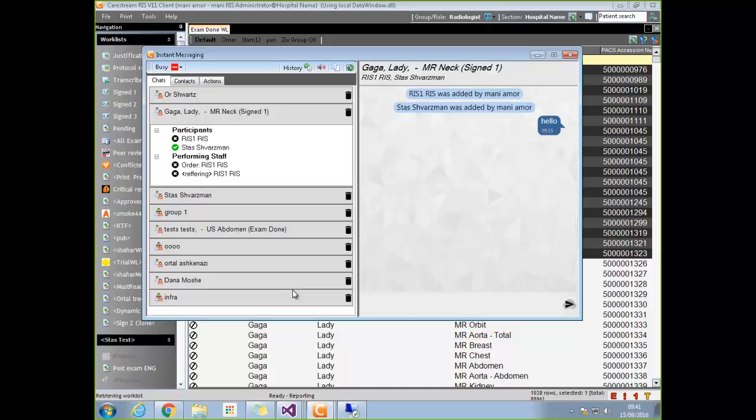I was actually thinking about that. For example, when you add somebody to a group, do they need to accept being part of the group, or is it automatic? They can leave the group, but they don't need to accept. Okay, so much like WhatsApp. Yes. And one other thing I was thinking, it would be nice to allow the user to add a status message, so they can tell, for example, at which site they are on that day, or their extension number or something. We actually have that down in the feature requirements, as well as contact information for the user, kind of like in Same Time. Same Time, exactly. Popping it up, yeah.